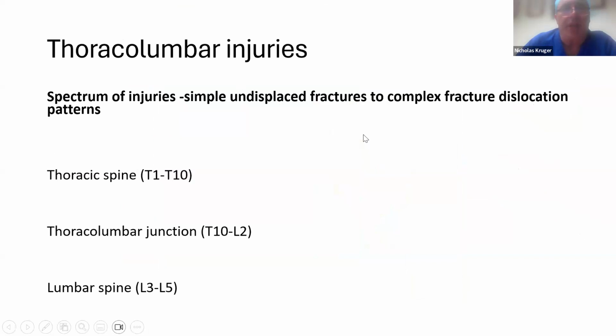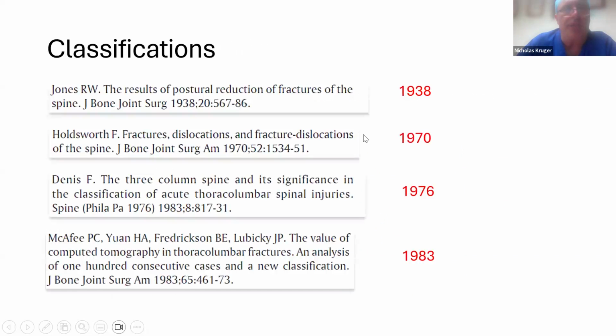Okay, let's go into the thoracic spine. This is when we get more into the AO classification. So we often mix our terminology. People talk about burst fractures and chance, wedge fractures, and it's probably words we understand because it's easy. I mean, you talk about AO3, B2.